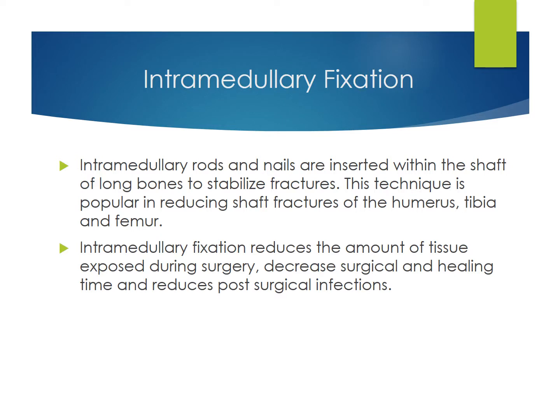Intramedullary fixation. Intramedullary rods and nails are inserted within the shaft of the long bones to stabilize the fractures. This technique is popular in reducing shaft fractures of the humerus, tibia, and femur. Intramedullary fixation reduces the amount of tissue exposed during the surgery, decreasing surgical and healing time, and reduces post-surgical infections.